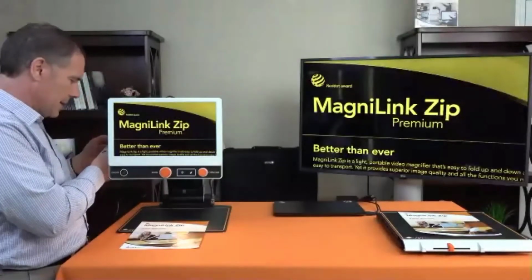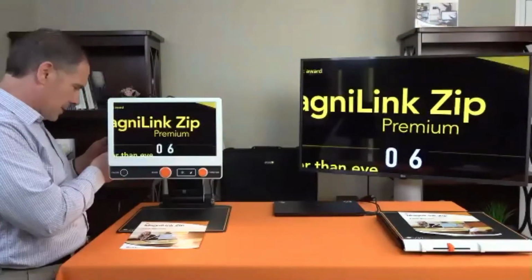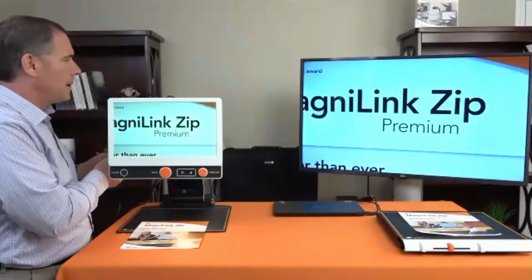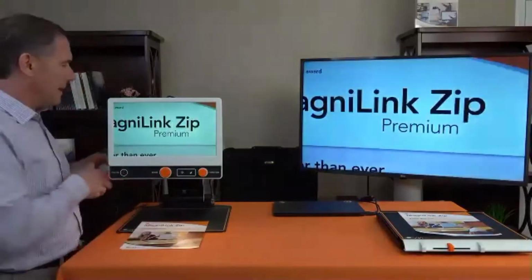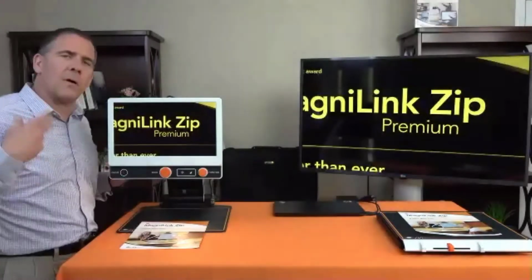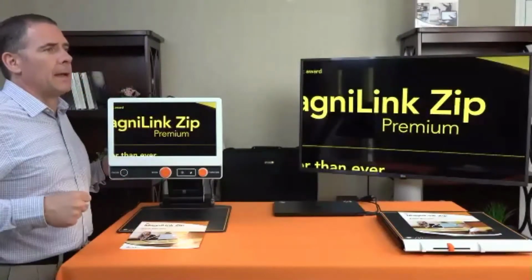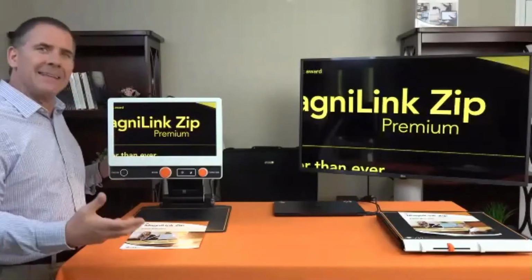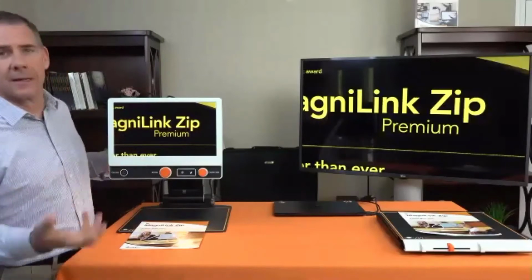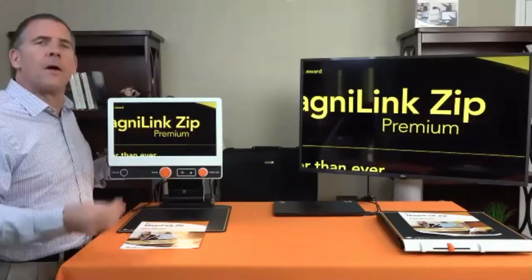And once I pick the one I like, it'll always stay there. So I can go back to color or back to my mode. Back to color, and then back to my mode. It's all about productivity with these. If I'm in the classroom and I want to keep going and stay with the pace of the teacher and what's going on, I know that's not really what's happening lately, but anyway, I don't want to fall behind.